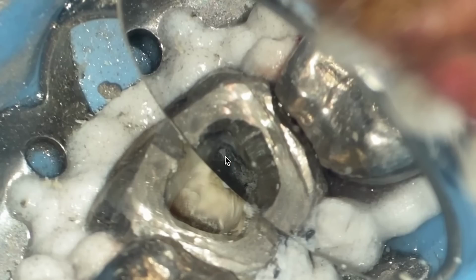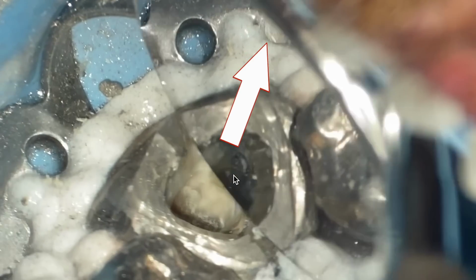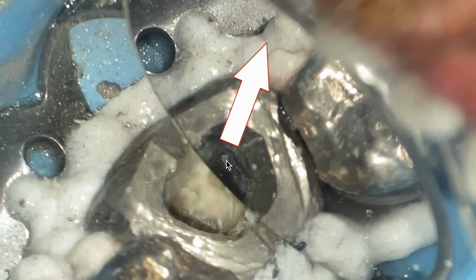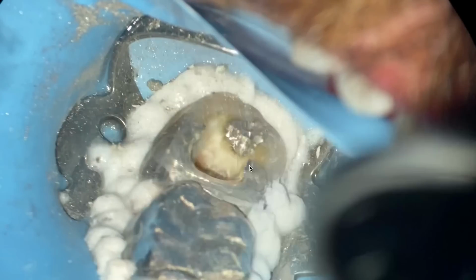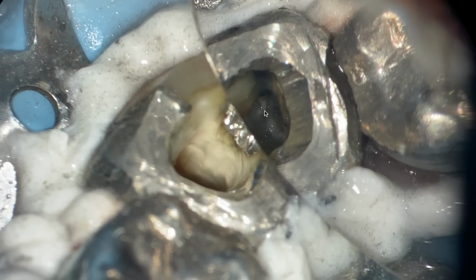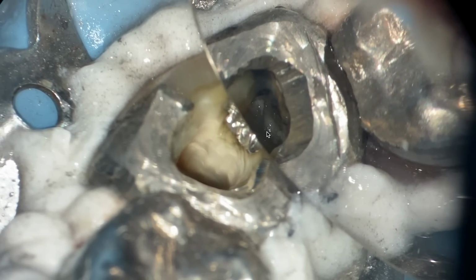So what I'm doing is I'm putting apical pressure towards the mesial buccal, the mesial part of the tooth. I'm not trying to touch in the furcation, and you can see we've opened up that mesial buccal canal. How do I know that's a mesial buccal canal? Well, when you have an orifice, the burr is spinning debris into that apical portion. So we do it dry. We don't use any type of irrigant because the dust literally going into the orifice is that clinical indicator. And there it is. So now we've got our mesial buccal, and it's as simple as that.